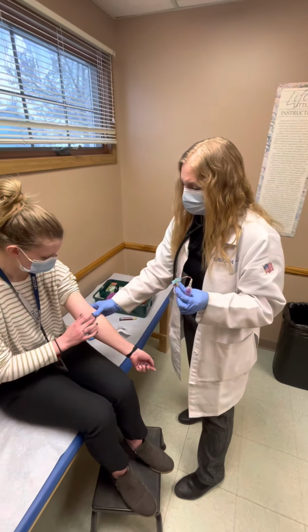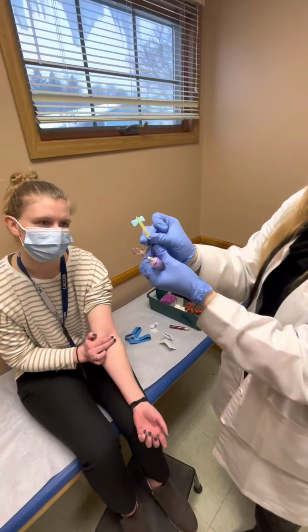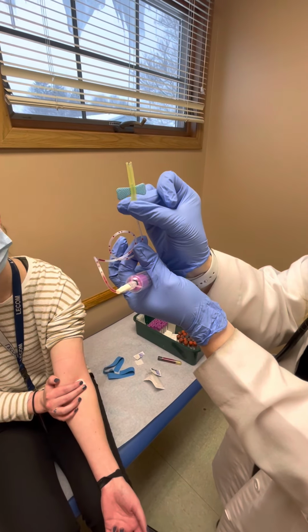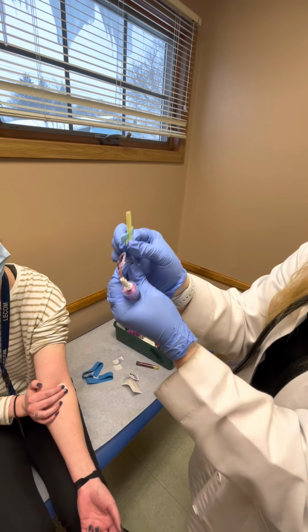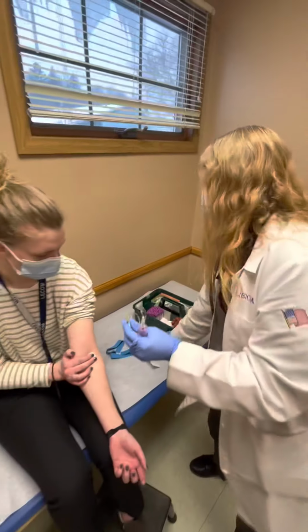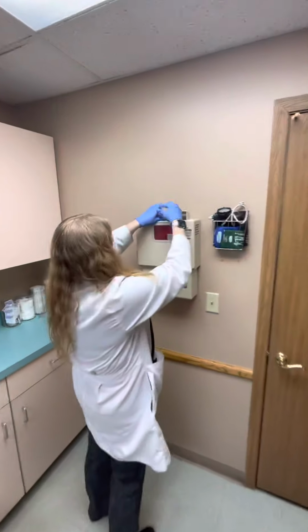You want to hold it for me? Normally I would do this, but I want to show you guys. Then the final thing you're going to do is slide up the yellow safety. You're going to hold the plastic tubing and slide the yellow safety up from the bottom until it clicks. Do not hold on to here or here, otherwise it will not go. So hold the plastic from the bottom and slide it up. That way it covers your needle, all right? Then the whole thing is going to go in the sharps container, which will be there somewhere for you guys.